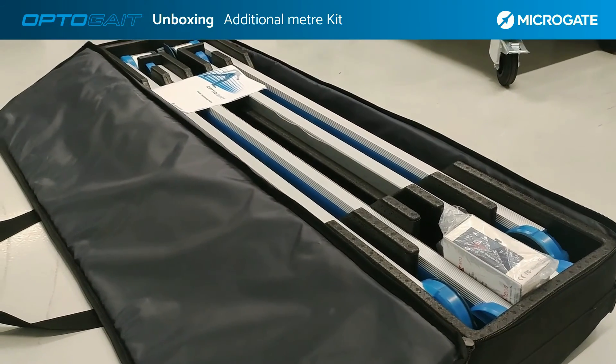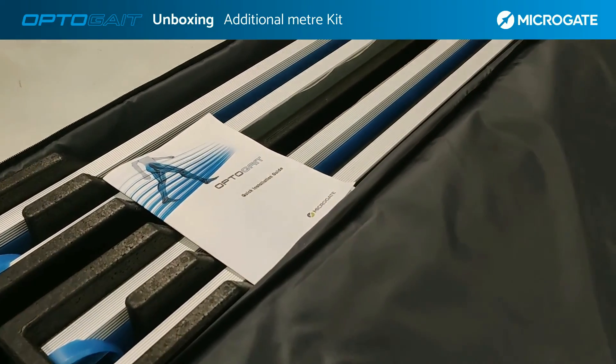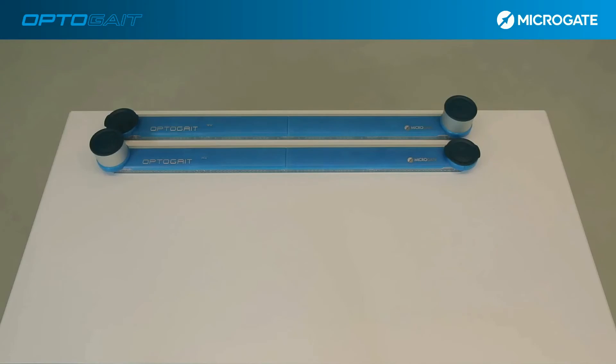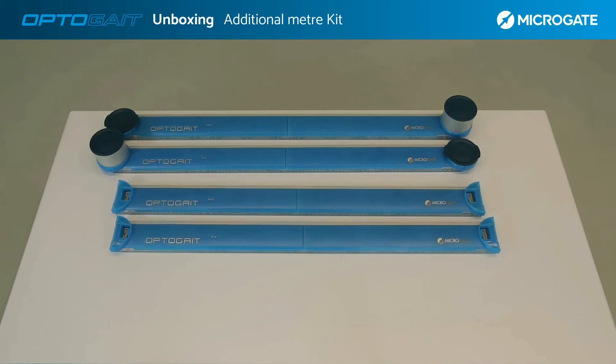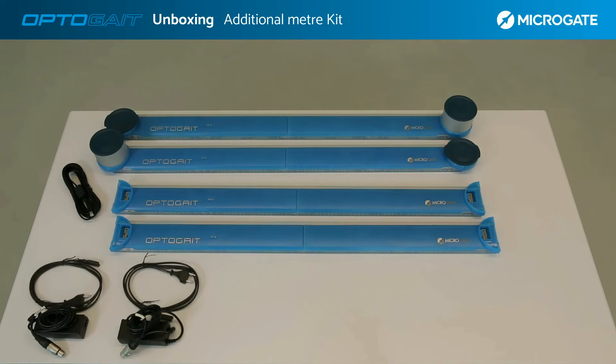For the additional meter kit, you can use the single meter kit bag, which can contain the basic kit plus an additional meter including accessories. Inside, we find the two bars of the basic kit with interface, plus two additional bars without interface — for a total of two TX bars and two RX bars. In the bag we also find the connection cable to the computer. In the configuration with multiple meters, two power supplies are available to power the two lines separately, together with cables for connection to the electrical sockets.